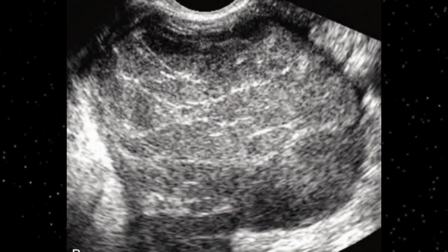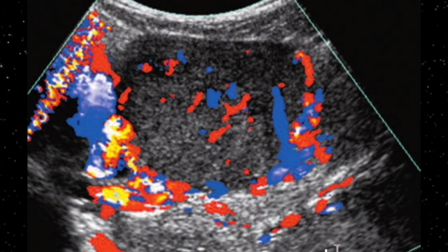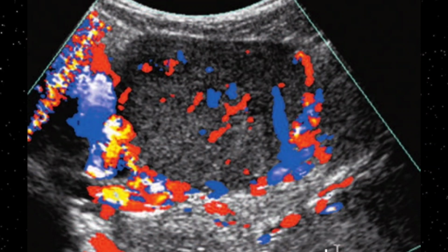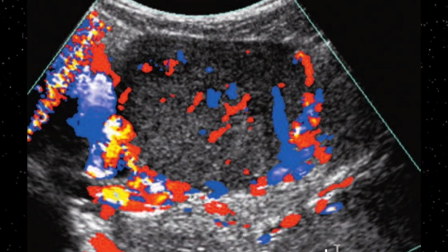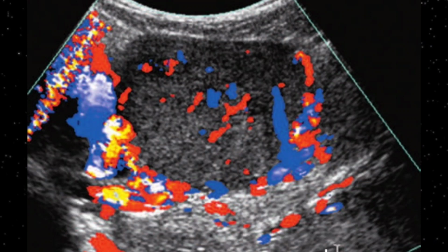So this is the dysgerminoma appearance on the ultrasound. This is a transabdominal scan, and it shows large but bilateral ovaries. Here, both on the right and the left side, bilateral ovarian masses with increased vascularity are seen. In the right side tumor, you can appreciate the vascularity clearly, which extends over the uterus. Just adjacent there is a uterus, and it's overlapping over the uterus as well. Note the enlarged left ovary due to tumor. So the left-sided ovary is also enlarged.